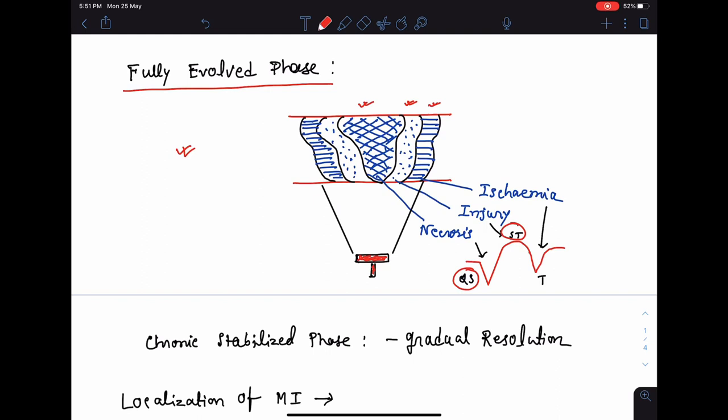The lead will recognize the injury as ST elevation with concavity downwards or convexity upwards, and it will recognize ischemia as an inverted symmetrical T wave. So this is the picture of a fully evolved stage of myocardial infarction: a negative QS complex or deep pathological Q wave, ST segment elevation with convexity upwards, and a deep symmetrical T wave inversion.